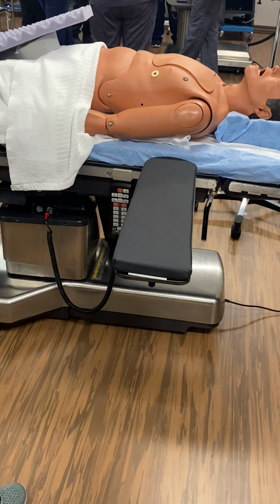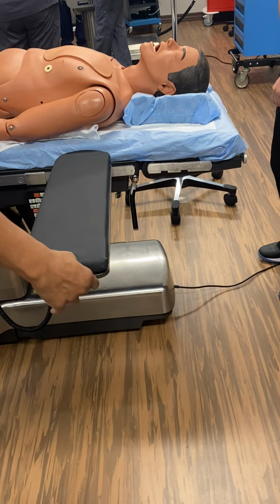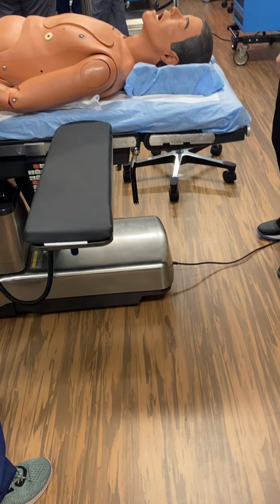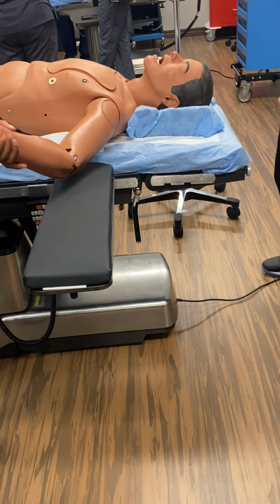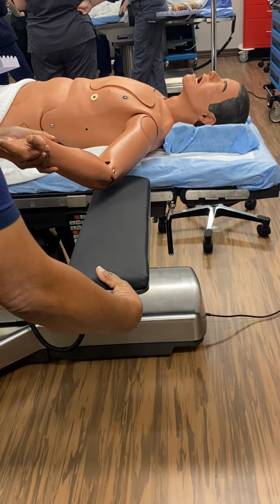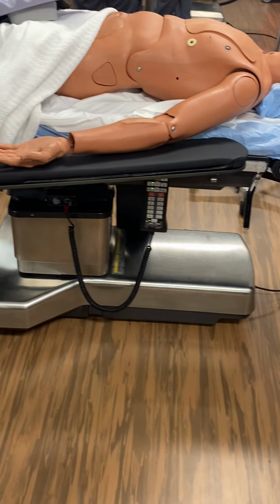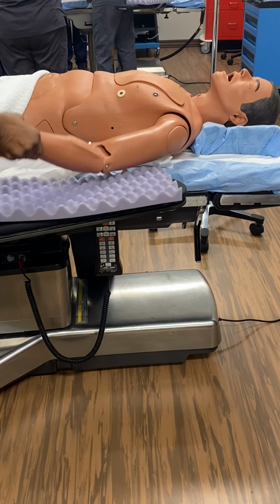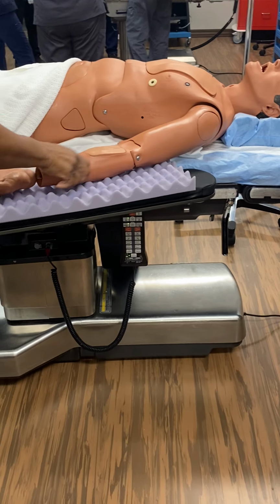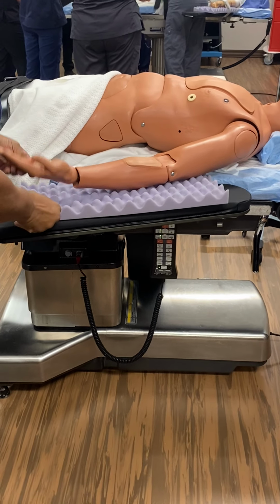So it's in place. If the patient's arm has IVs or something, it can take you 10 minutes to get it on, because it's just hard. His arm is not that flexible. I want to make sure the mattress isn't pushing his arm out, and that the padding is underneath them. Usually you have a pad under here to prevent pressure sores on the ulnar nerve or anything like that, okay?